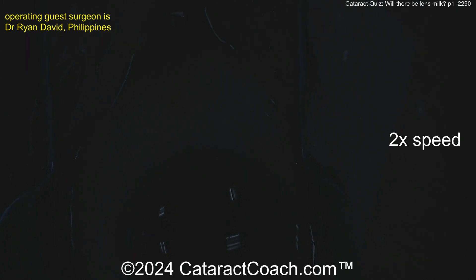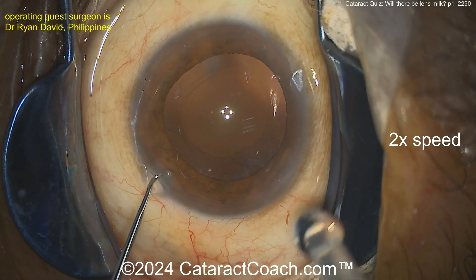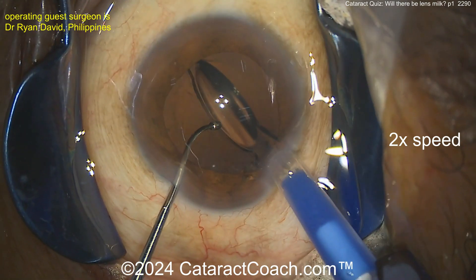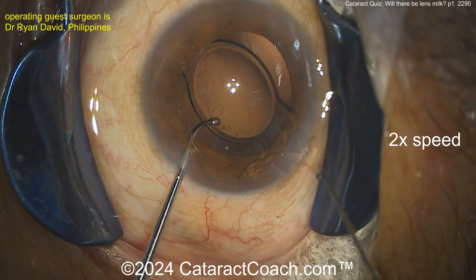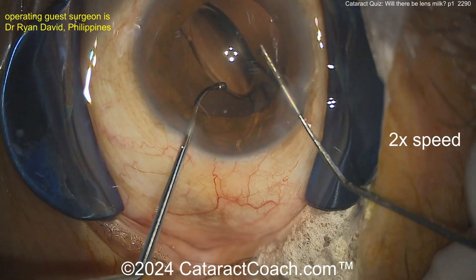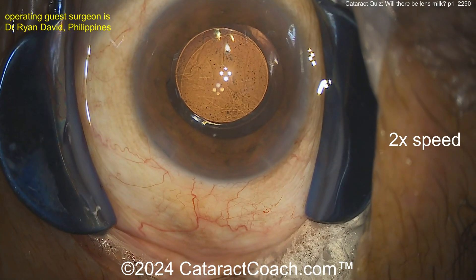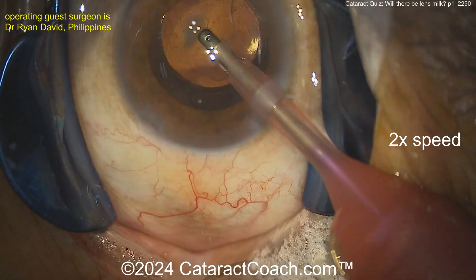Everyone has to know how to load the lens because one day you may have a scrub tech who doesn't really know how, and you want to be able to do that on your own. There we go, light back on - here comes the lens, a single-piece acrylic lens. Chopper fixating the eye, and here comes the lens. Get that flipped over to the correct orientation - you did that, don't want it to be the wrong way. Two instruments going in, get it flipped correctly, and now deliver that into the bag.